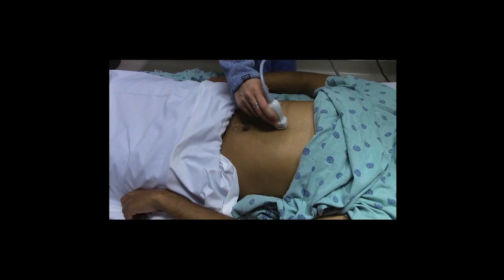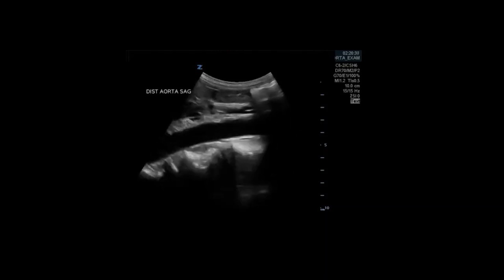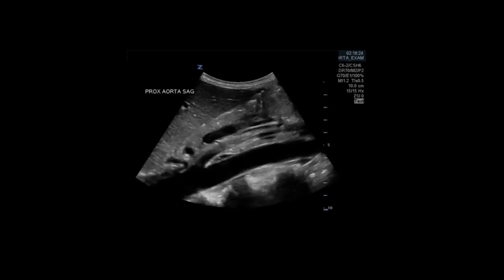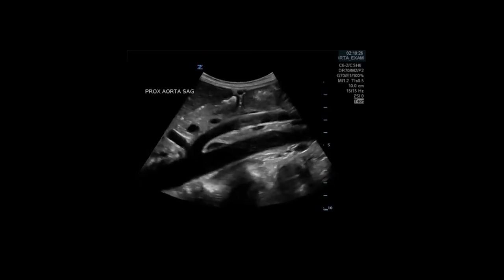Last, we now want to image the aorta in the longitudinal plane. Visualize the aorta and rotate your probe 90 degrees, turning the indicator towards the patient's head. Try to visualize the aorta throughout the rotation of the probe. Now follow the aorta superiorly, visualizing the entire abdominal aorta in the longitudinal or sagittal plane. Again, note the vertebral bodies imaged deep to the aorta. As we move proximally, we are again able to visualize the celiac trunk and SMA arising from the anterior abdominal aorta.